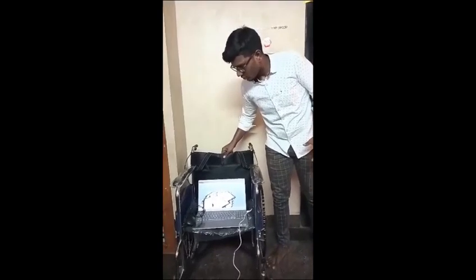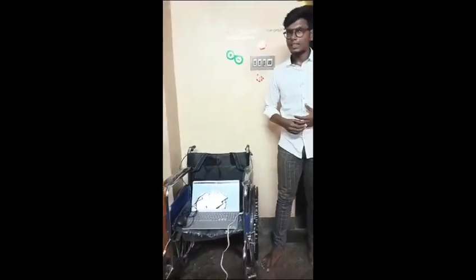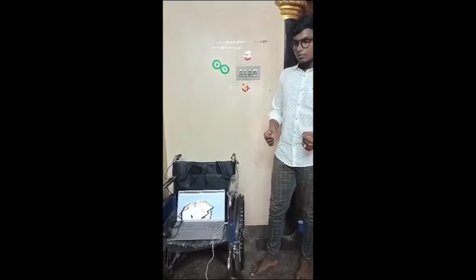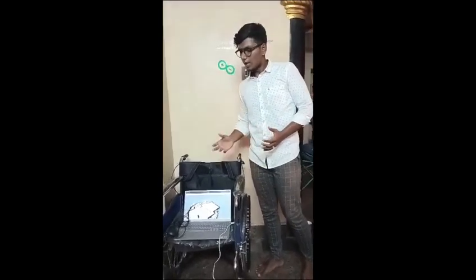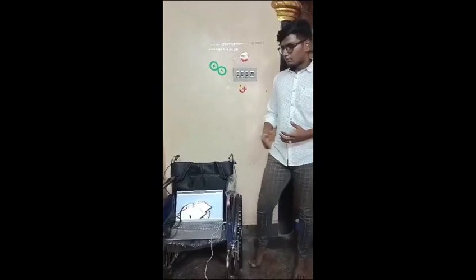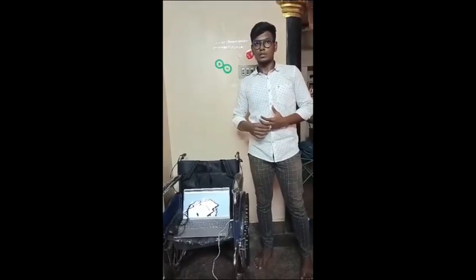Once I move the robot, the AMCL algorithm will detect the robot's accurate and precise localization. And I am using IMU sensors here for making the localization, and wheel encoders and LiDAR also. And we are using some new technologies for making a high level autonomous wheelchair.